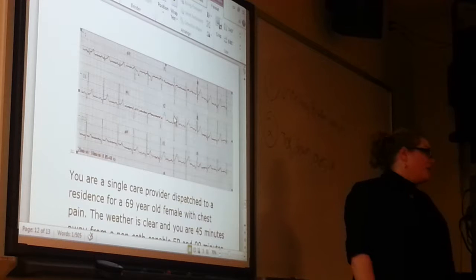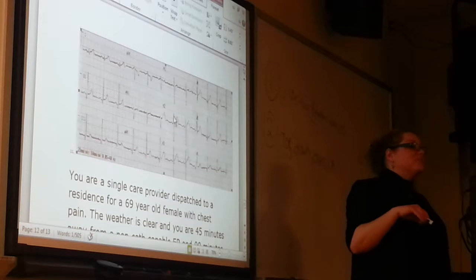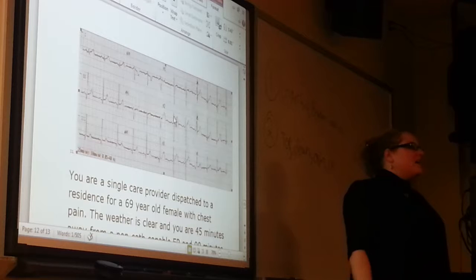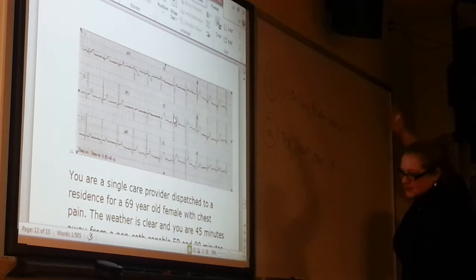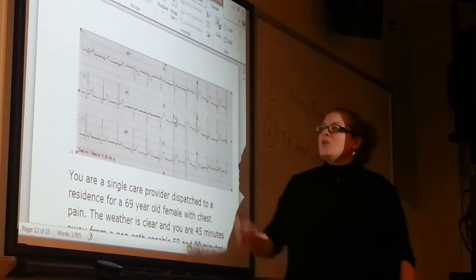And I actually have a smiley face worksheet for you guys that's awesome, where I'm going to show you how to do it. Okay, all you need to know when you walk out of here tonight is that if it's positive amplitude, it's what side? Right. Okay, good. And if it's negative amplitude, it's the other one, left. Okay. All right. Good.